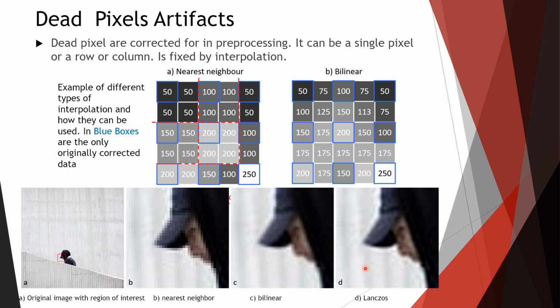And each manufacturer is going to have their own proprietary software. They're probably going to be more similar than different from each other, but they still put in a lot of research on how to interpolate the data properly. And that's just filling in a pixel slot for the final image.